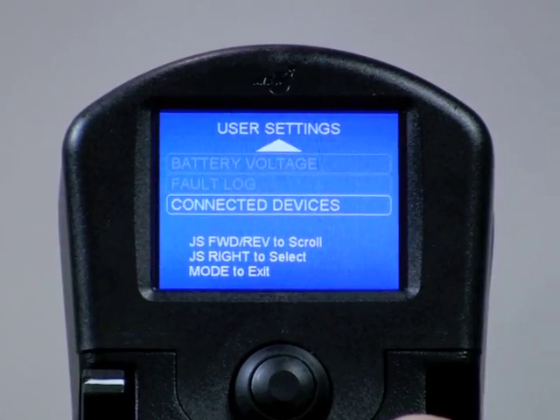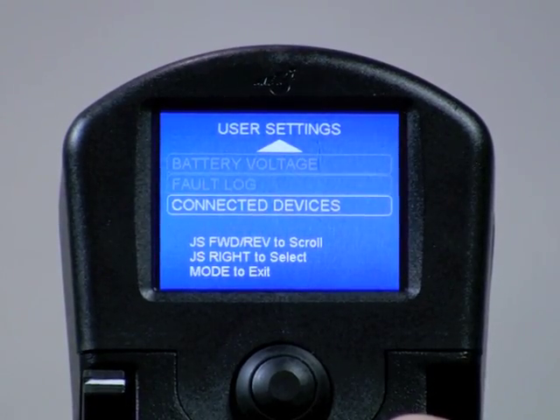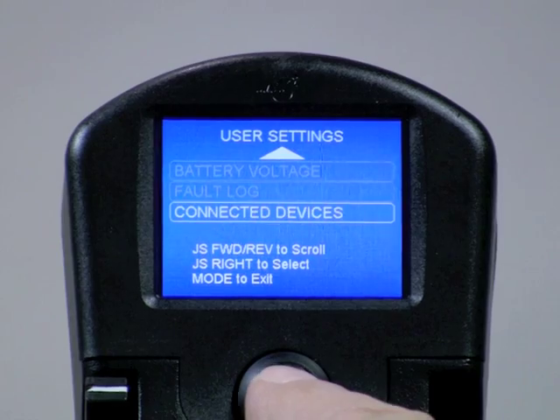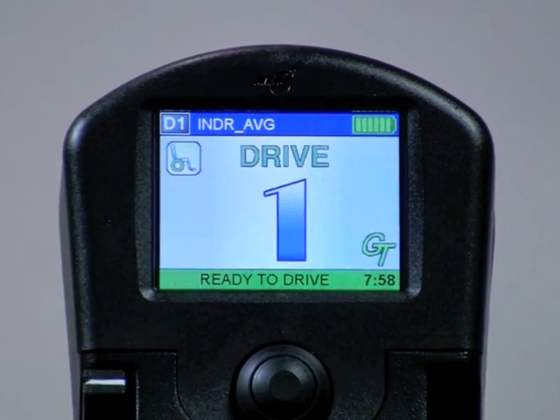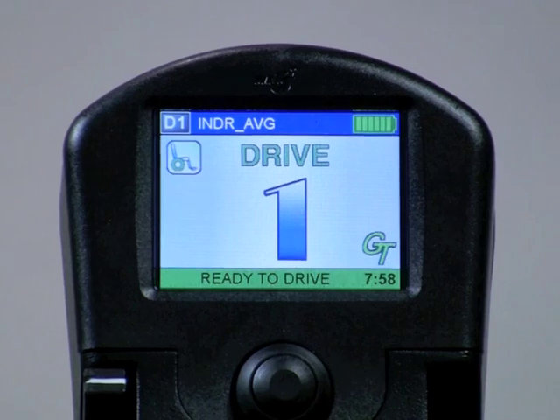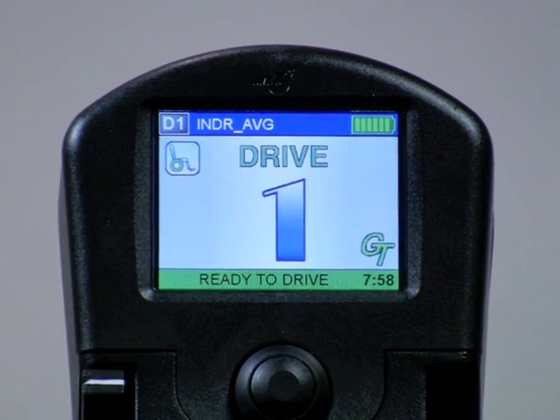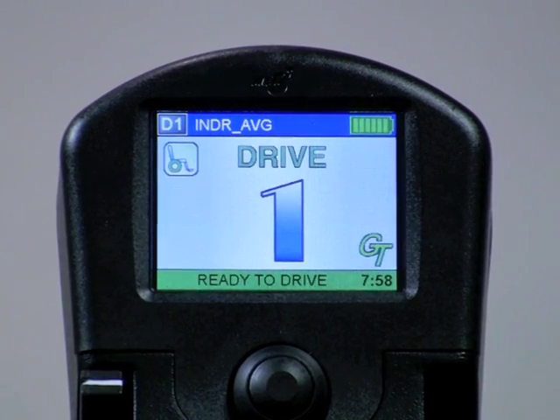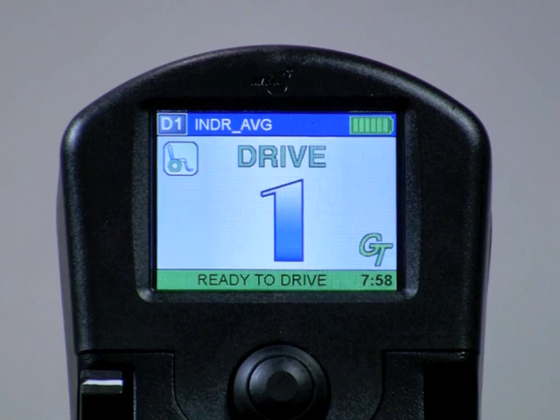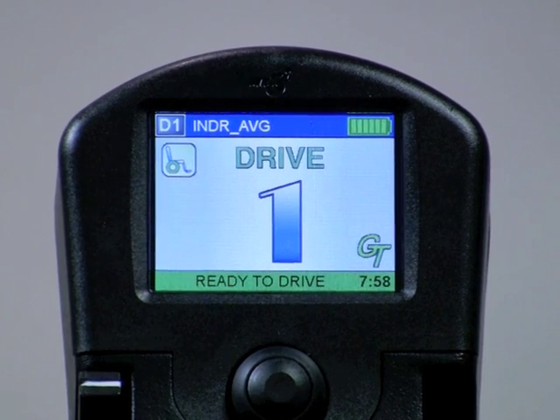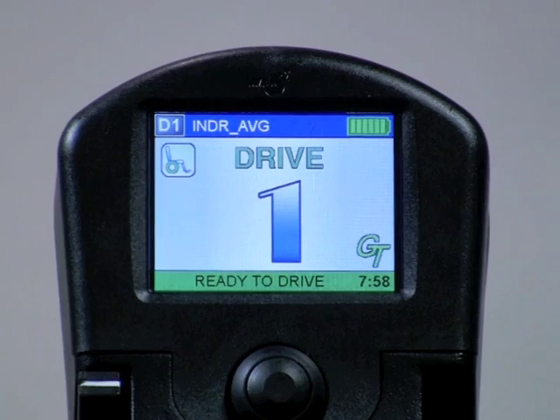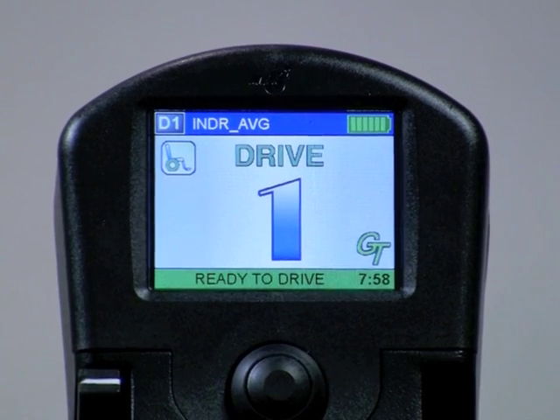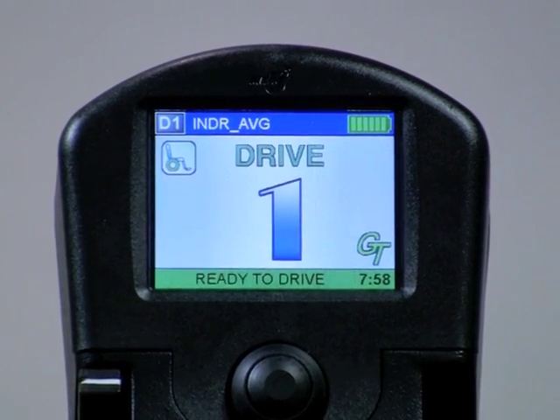When finished with the user access settings, use the mode button to exit back to the home screen. In summary, these user access settings are very helpful for both the user, the rehab technology supplier, and the technician. I hope this short video was helpful in explaining their use.